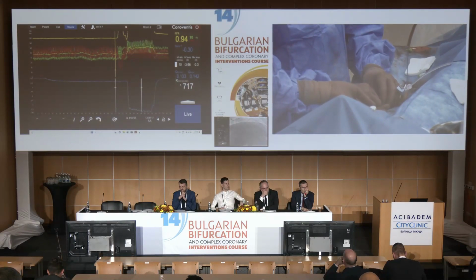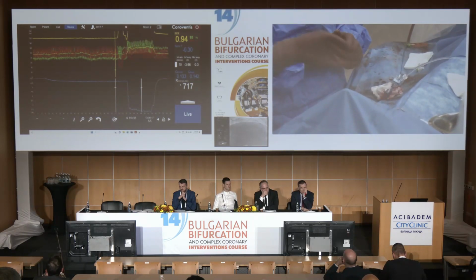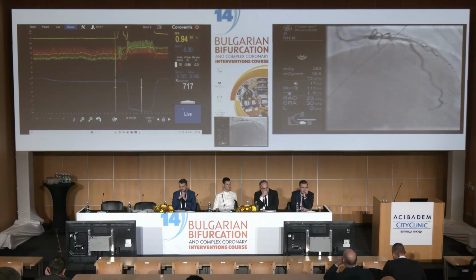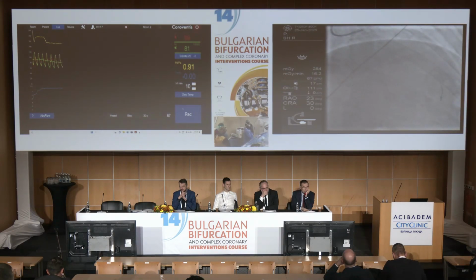Fantastic. Okay, if you don't mind, we are still again in position. And now we are going to go live again. Please do not touch the patient. Do not touch the patient. Make sure that the PA and PD are visible.